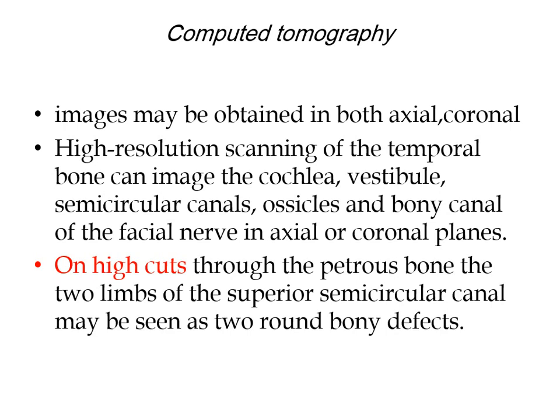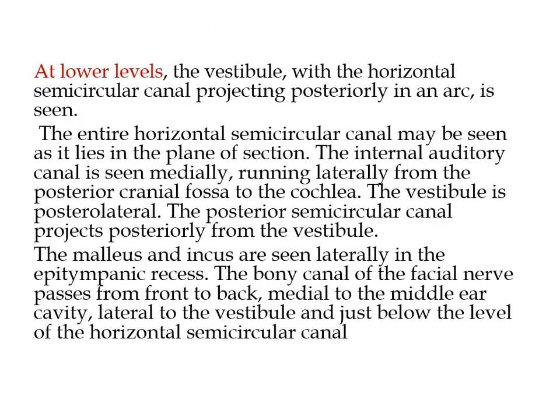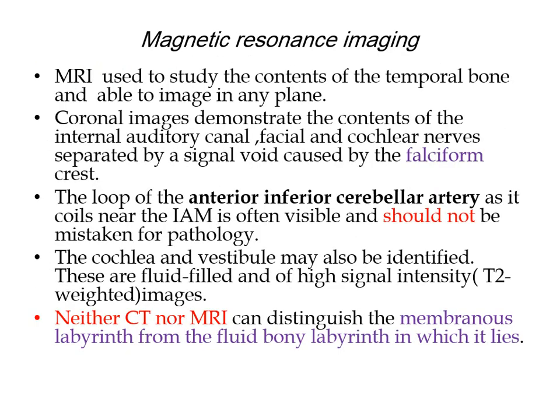High resolution scanning of the temporal bone. How much is the slice thickness? Would you recommend 2 millimeters? 2 millimeters is too much. 1 millimeter or less. 1 millimeter if possible, 0.8 or 0.7 millimeter is even better. 2 millimeters is too much.